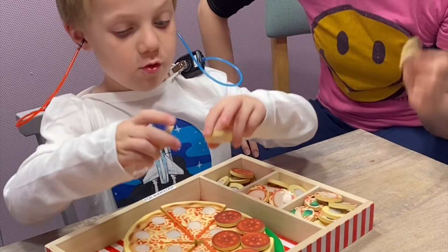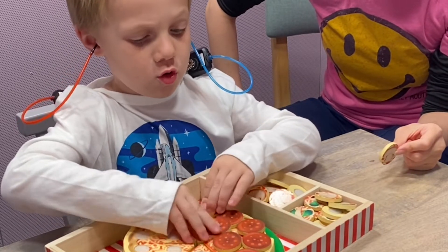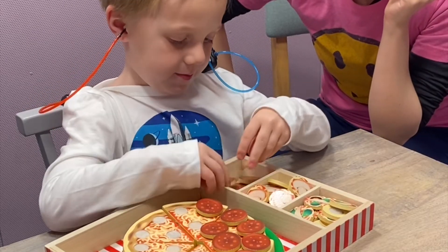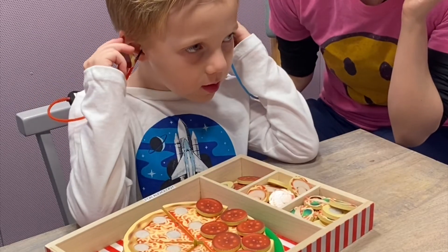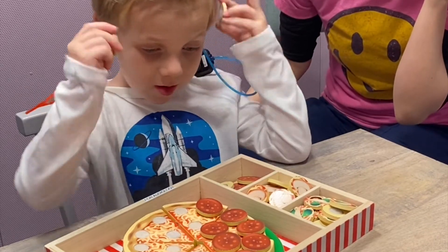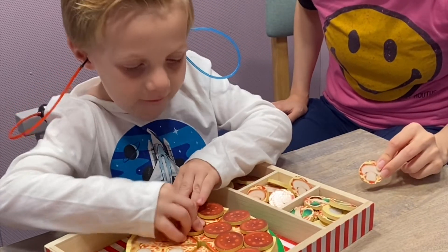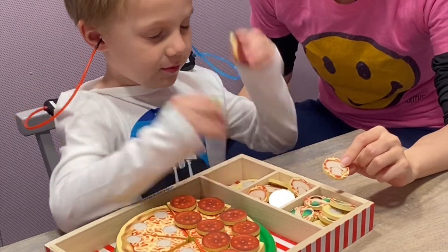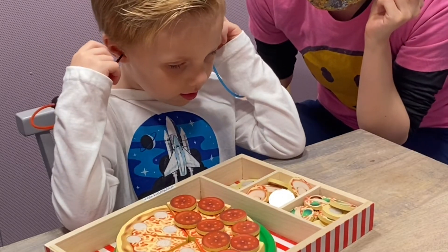We can also perform this task on older children to help maintain their attention while keeping it fun. You'll notice here that we have the pizza game with a number of toppings. He grabs his toppings and places them up to his ears in the ready state. When he hears the sound, he places the topping on the pizza. We can do this a number of times to find the child's hearing threshold, the softest level where they detect a sound.